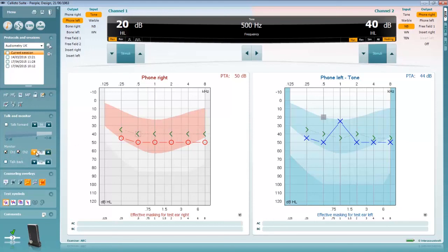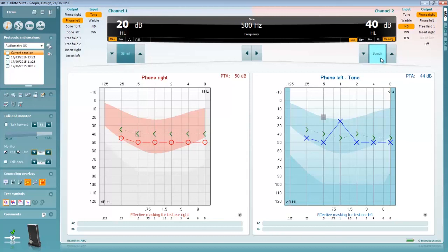The talk back function allows you to listen in to what the patient is saying inside the booth via a microphone in that location. This audio will be routed to a headset that you are wearing.